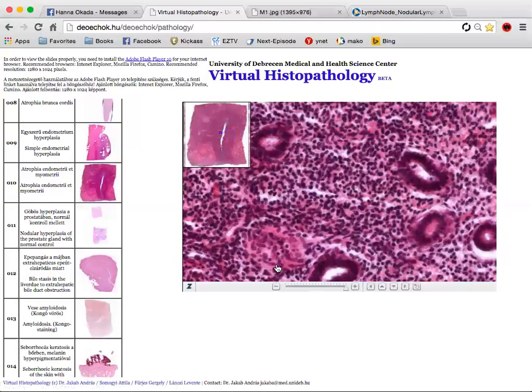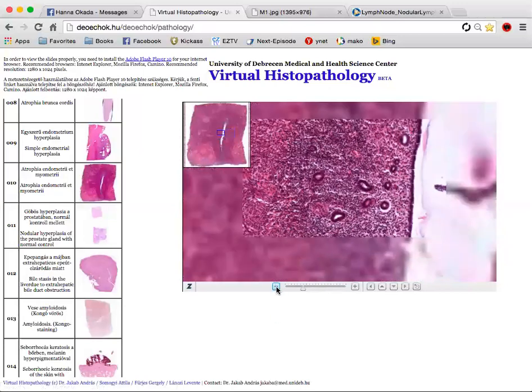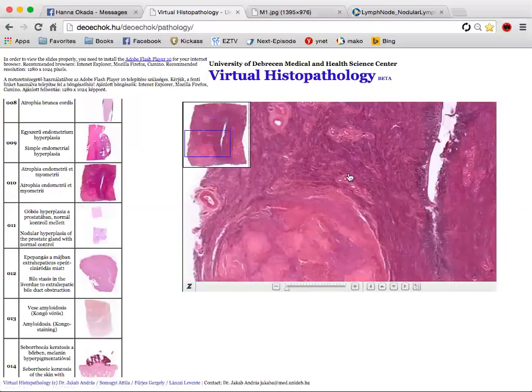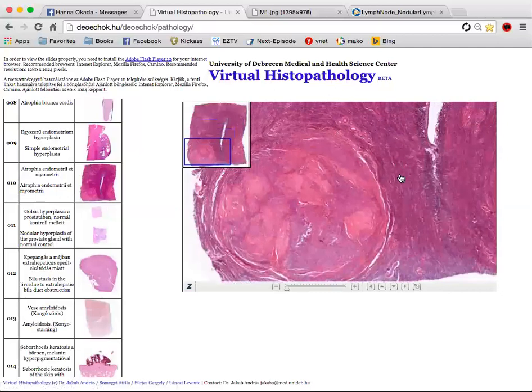And again, this is because of lack of hormonal stimulation, so no estrogen. The opposite of the previous slide. Exactly. And this area was probably left over from when this woman was younger, because leiomyomas are also influenced by estrogen, but you'll still have this little tumor here. And this is a smooth muscle tumor.